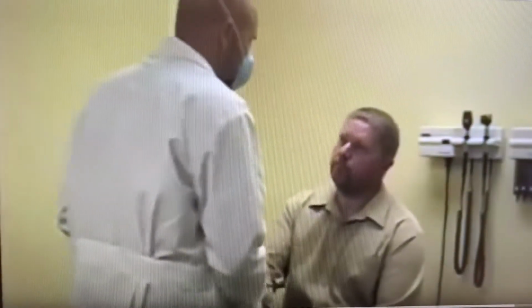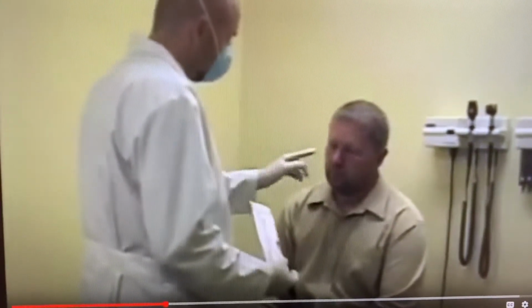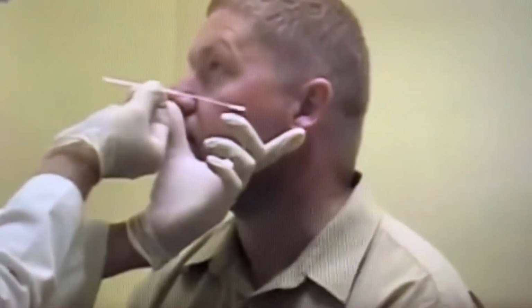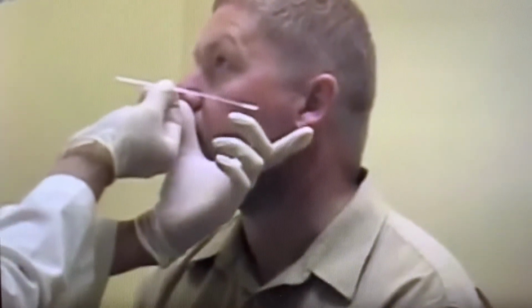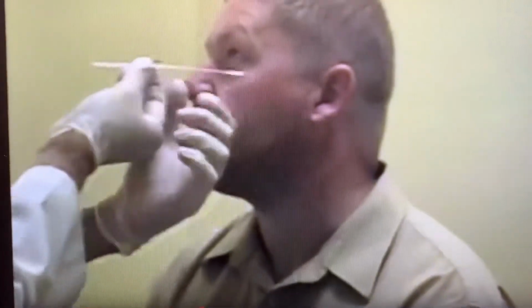Explain the procedure to the patient, telling them they may cough or their eyes may water. Ask about a deviated septum, and get the patient to gently remove excess mucus from their nose. Estimate the distance by measuring from the corner of the nose to the tip of the ear. It is important to insert the swab only 1/2 to 2/3 this distance.